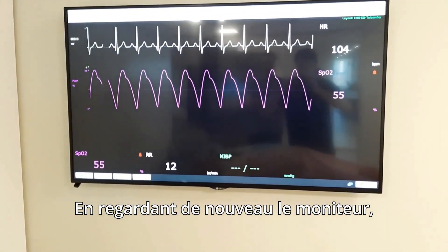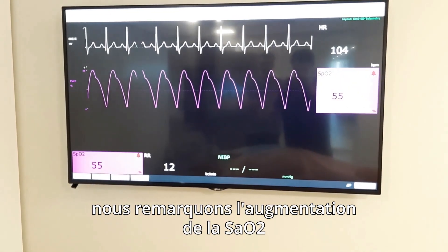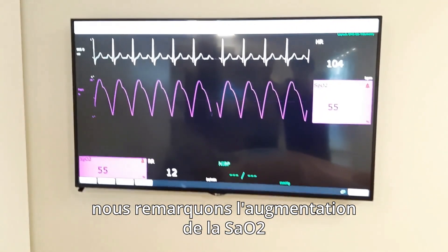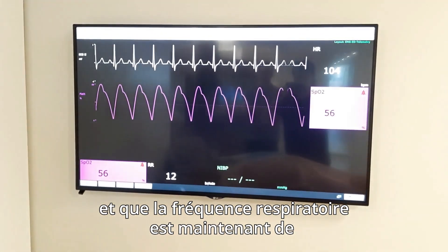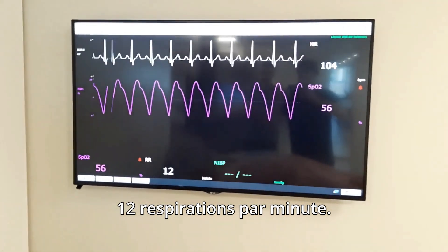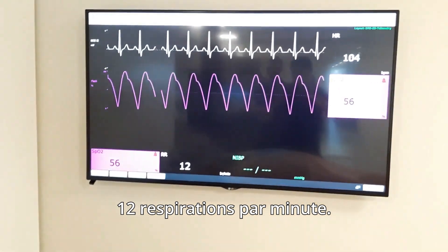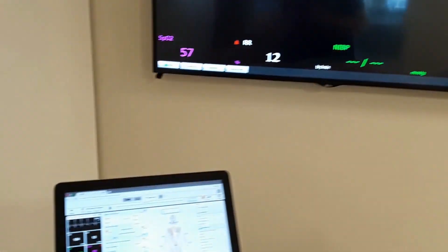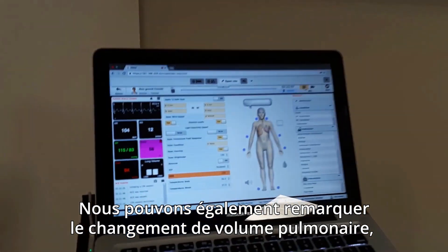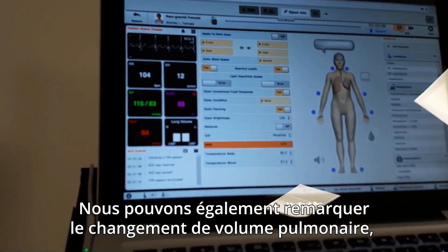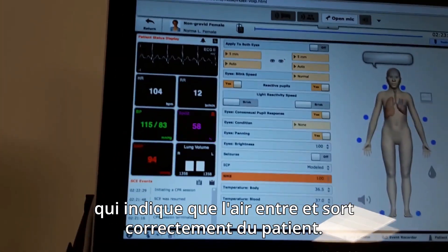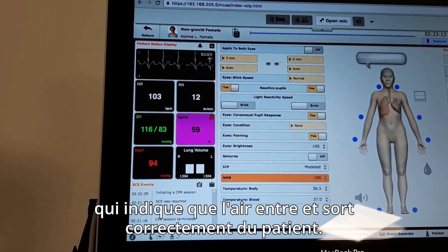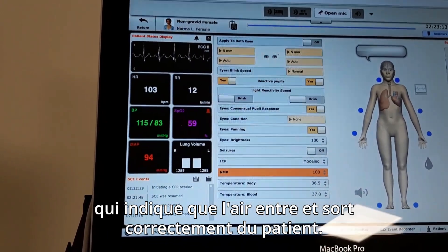Taking another look at the monitor, we notice the rising SpO2 and that the respiratory rate is now 12 breaths per minute. We can also notice the changing lung volume, indicating that air is properly flowing in and out through the patient.